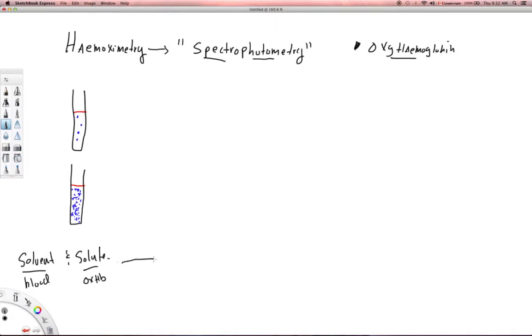Well, when it comes to labs, there are some other terms that I just want to throw out there. You have what's called your media, and your media is kind of like your solvent. So you have your media or your matrix. Some people will say matrix, and that's what your thing of interest is dissolved in or suspended in.